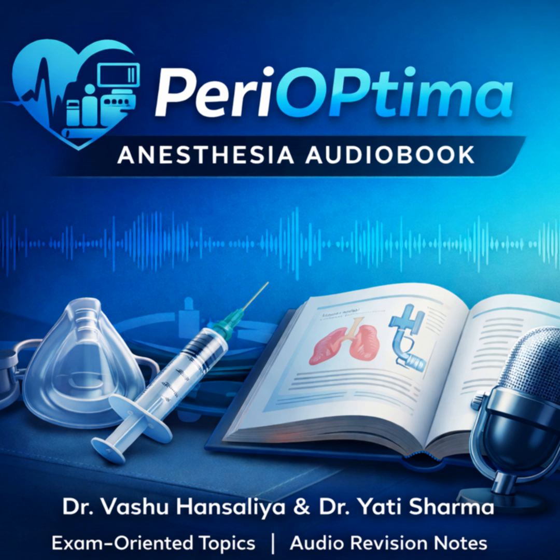How do these work? They rely on heart-lung interactions. When a patient is on a ventilator, the positive pressure breath squeezes the heart. It increases intrathoracic pressure, which decreases venous return, the preload to the right heart. And then a few beats later, that translates to a drop in left ventricular output. If the patient is empty, if they're fluid responsive, that squeeze causes a significant swing in the blood pressure or stroke volume from beat to beat. If the tank is full, the heart doesn't really care about the squeeze. The variation is minimal.